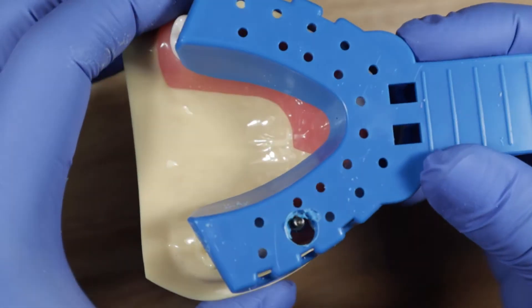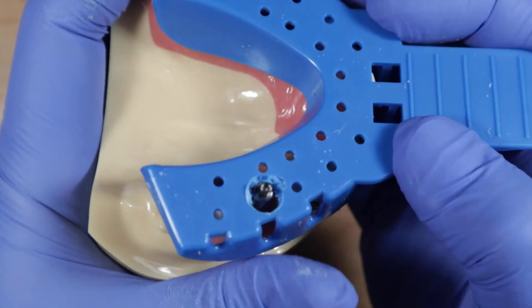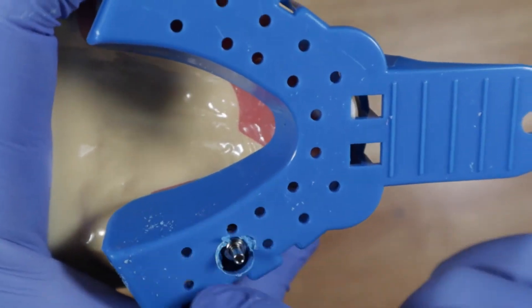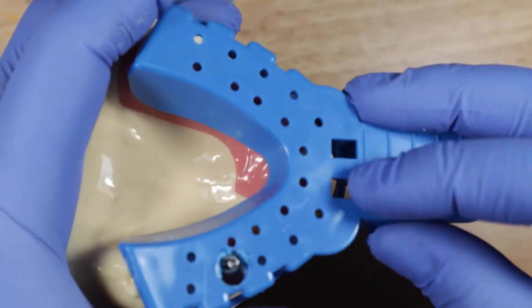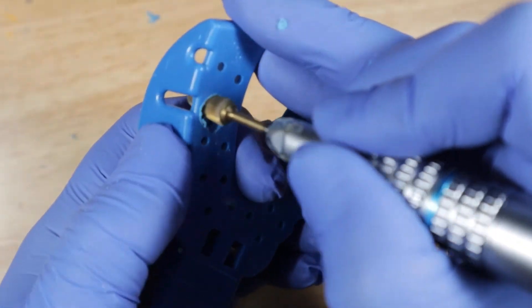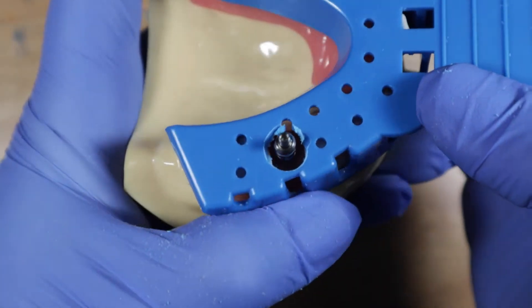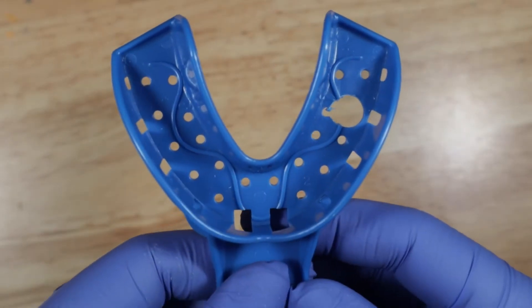I've made my initial hole in the tray. Put it over the patient's teeth and see if you're in the right area. That's pretty close — I'll make the hole just a little bit wider to make sure the impression coping still sticks through and isn't binding around it. Once you put impression material inside it's harder to find that coping, so let's open it up a bit bigger. Now it's bigger, looks pretty good — not binding anywhere, showing through nicely.